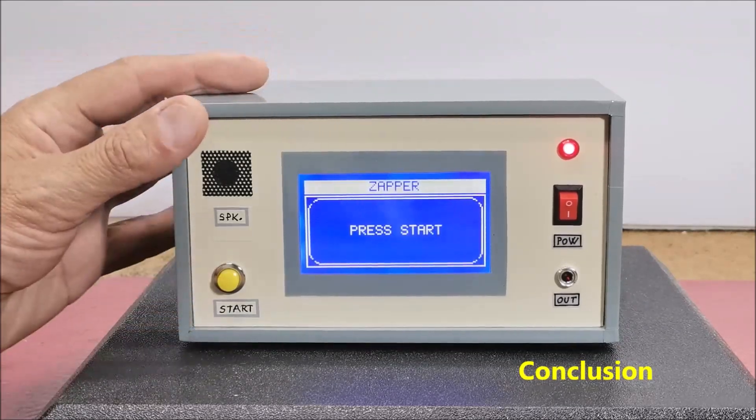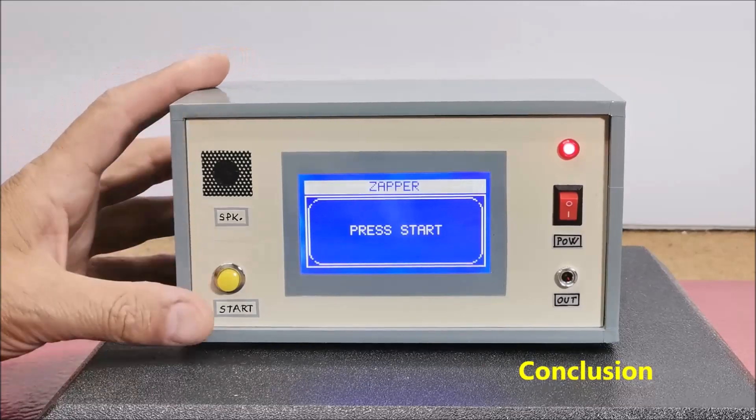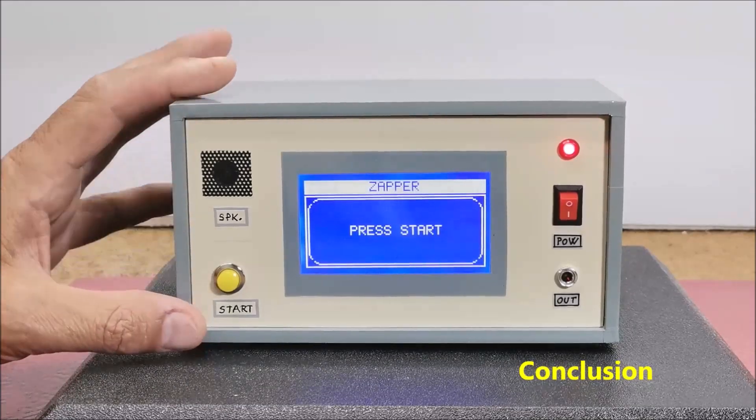The device is installed in a suitable box made of PVC board with thickness of 3 and 5 mm and covered with a self-adhesive colored wallpaper.